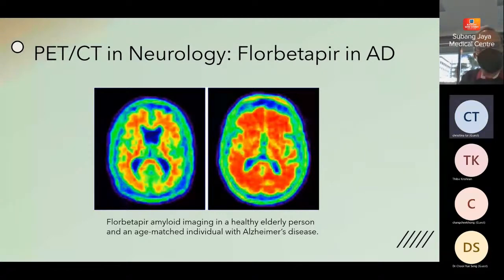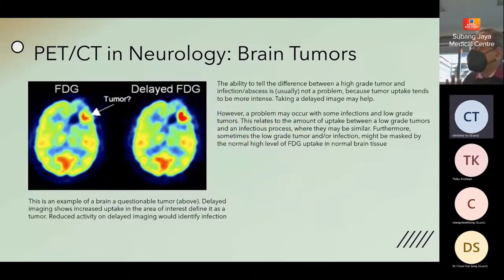Source here. Right. Now the problem with the brain is that it uses a lot of glucose. And because of this, small lesions may not be visible. In fact, for most of our oncology patients, what we detect on PET scans is not so much the brain metastasis, more like the edema that surrounds it. The edema causes a reduction in uptake. You usually see the cold area in the brain mets more than the high uptake, and it's because the brain activity is so strong.